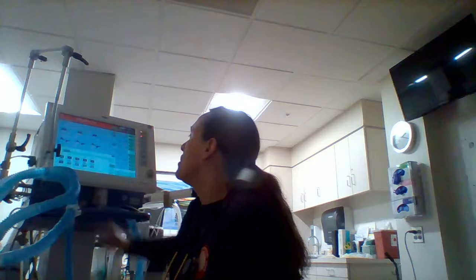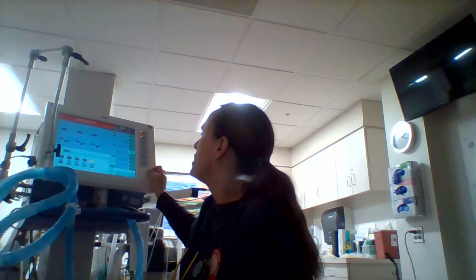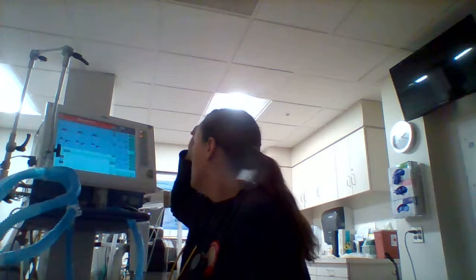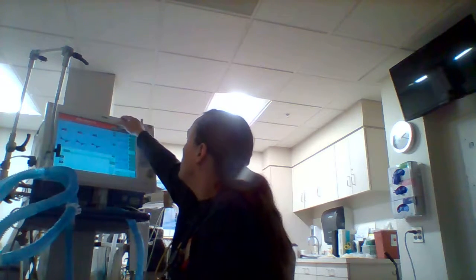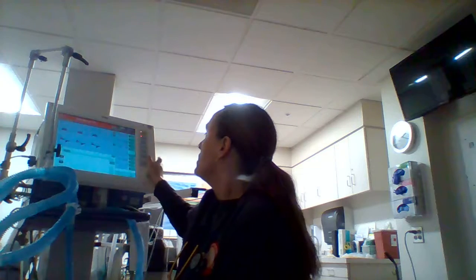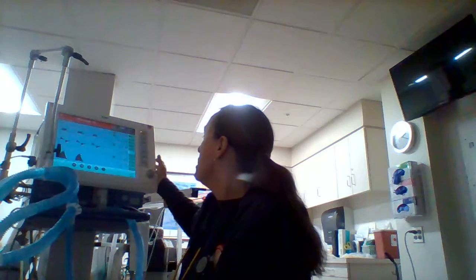He's set at 7, low is 2.9. Apnea, I gotta change it to 15 for the protocols here. Perfect. ETCO2, high 60, low 30. Okay. And that's for the CO2 sensor that would be in the system, not like an ABG.